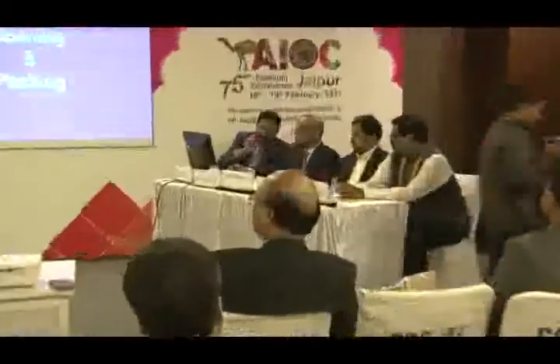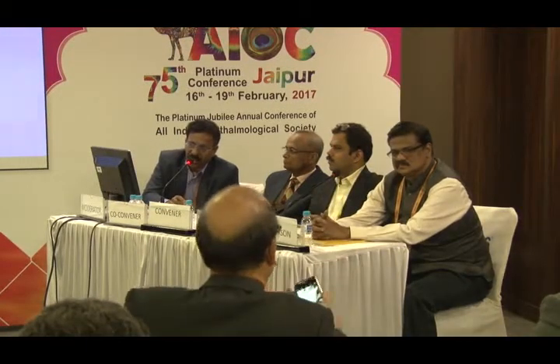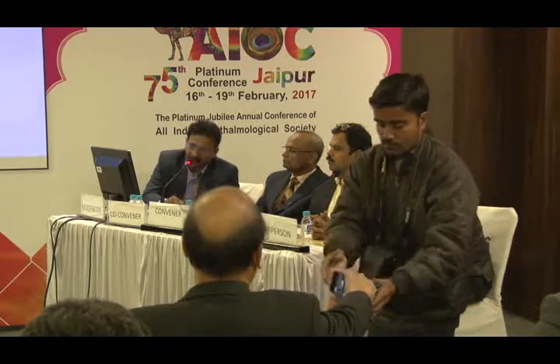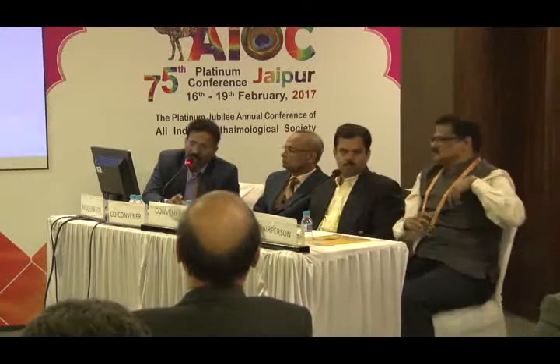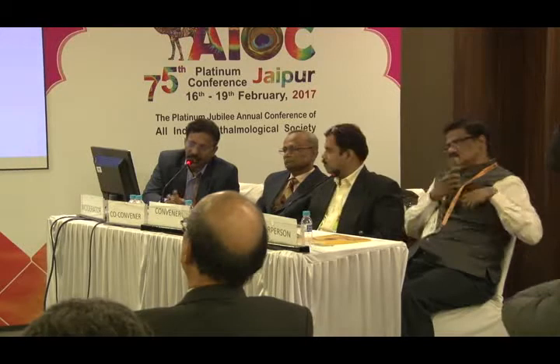Actually, sir, many vendors sell this unit to ophthalmologists saying it has all the 6 mechanisms of air filtration, but it's not validated. So if at all you want to buy, ask for validation, and also ask them to install it properly and then give validation again. Because many of these filtering mechanisms do not work beyond 3 months. It gets clogged, and after that it is just a blower. So it is not a filtering unit.